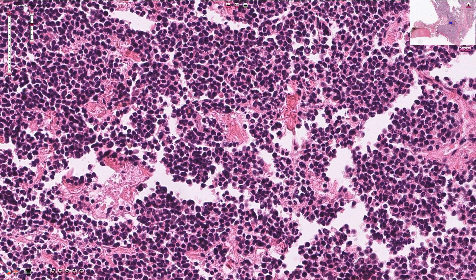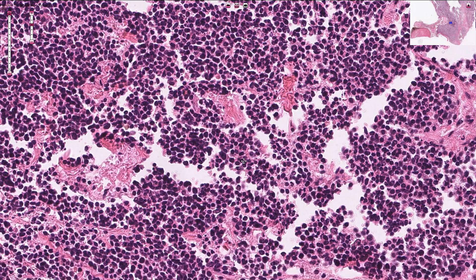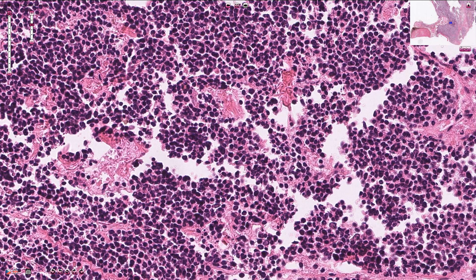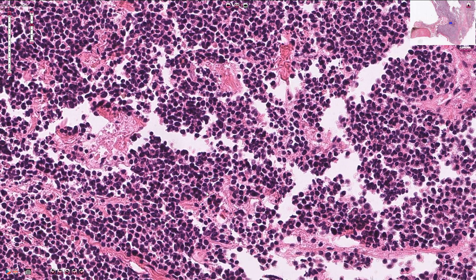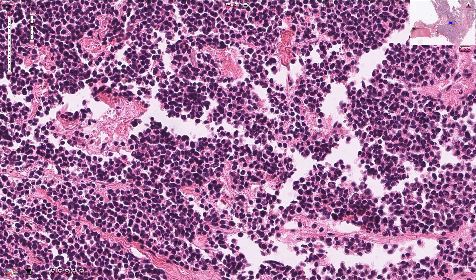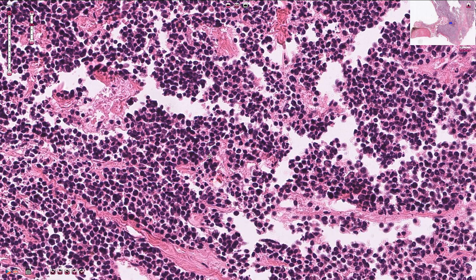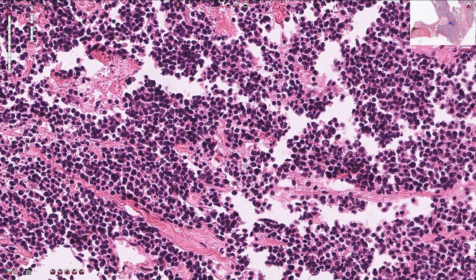If we see prominent nucleoli we need to think about differential diagnosis. Sometimes squamous cell carcinoma can mimic small cell carcinoma and we need to do immunohistochemistry. The neuroendocrine cells are positive for synaptophysin and chromogranin A and also for CD56 on immunohistochemistry.